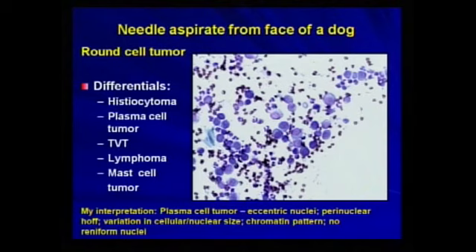I'd like to know more about the age of the dog. A younger dog is more likely to be a histiocytoma. And if the clinician wants to, I'm more than happy to look at a second aspirate or a surgical biopsy.